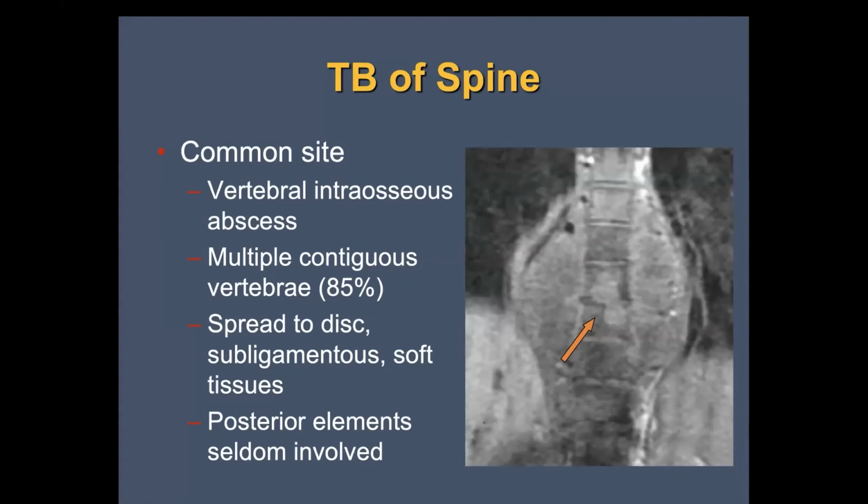And the other important finding that is pretty pathognomonic, as you see these very profound exudates that is caseating material that just spreads in the subligamentous area in the paraspinal region and gives you these very prominent paraspinal collections that you won't see with other types of vertebral osteomyelitis or metastatic disease or other things that might cause vertebral destruction in children.